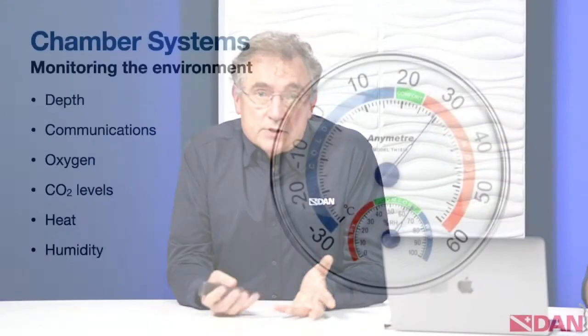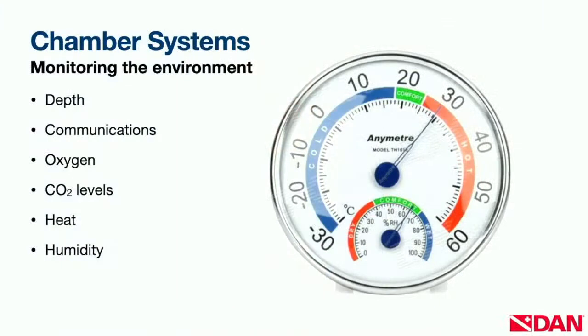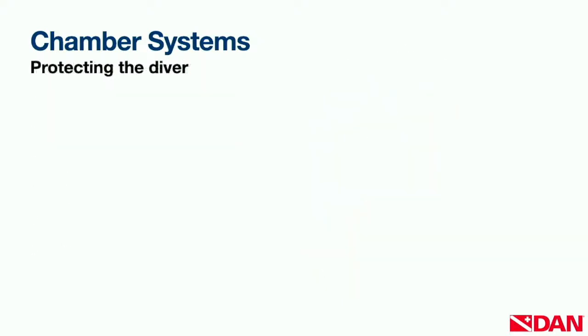And then lastly, creature comfort. We try to keep our chambers at round about 70 degrees Fahrenheit, or 20 odd degrees Celsius, which is comfortable. And we try to keep the humidity down, not too dry, so that we don't generate static electricity, and not too moist, so that we don't end up perspiring excessively. But it's going to be humid inside there, and we want to manage that as best we can, again flushing out the air inside the chamber in these kind of periodic cycles.